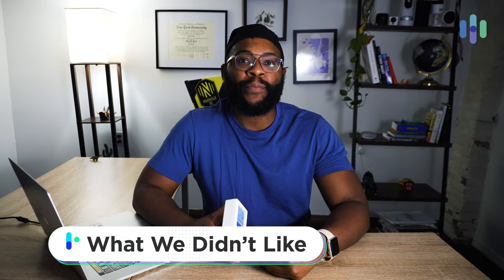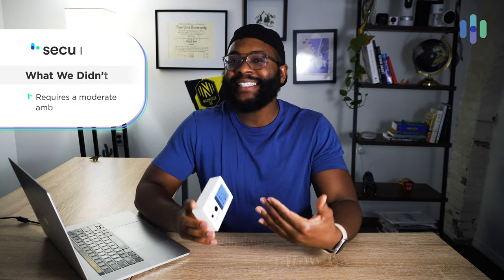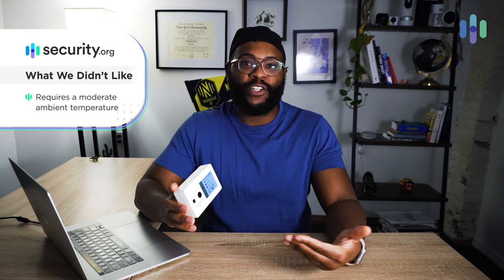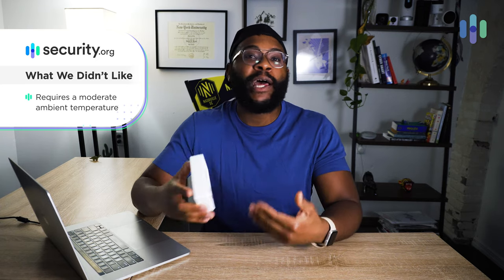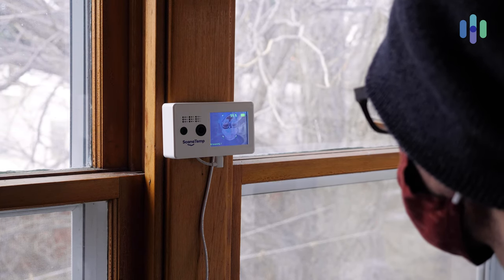What didn't we love about Scan-a-Temp? Well, it requires a moderate ambient temperature, which means it just does not work in the freezing cold winter of Brooklyn. We tried to set it up outside to see if it would function correctly. Fortunately, it said the ambient temperature is too low. Once we moved inside, it worked fine, detecting our temperatures accurately.